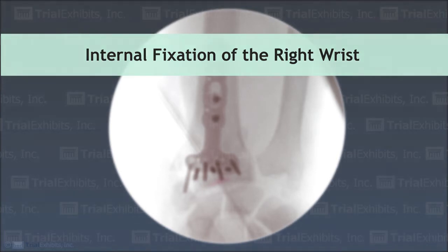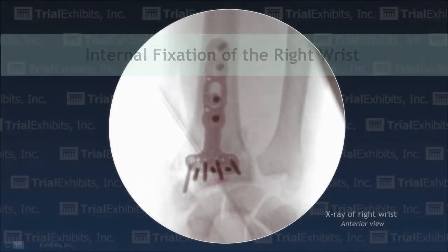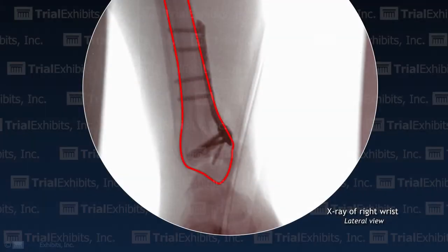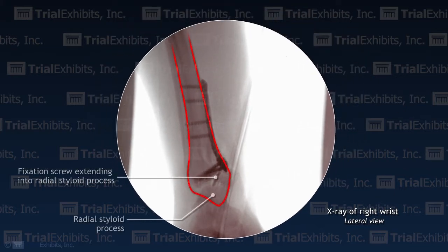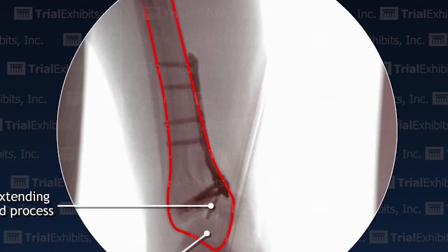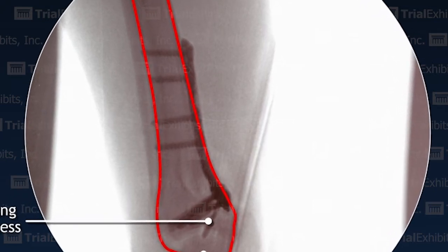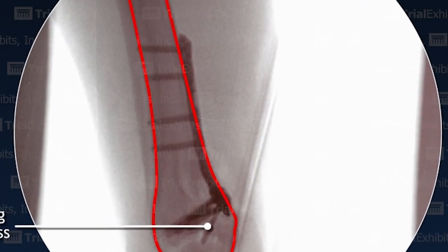A three-dimensional view of the problem our client faced. A difficult challenge in this case while representing a surgeon who repaired the plaintiff's broken wrist: the lateral postoperative x-ray clearly shows that one of the fixation screws penetrates through the bottom of the radius into the joint space. This would seem to be clear-cut evidence of malpractice, but things are not always as they seem.